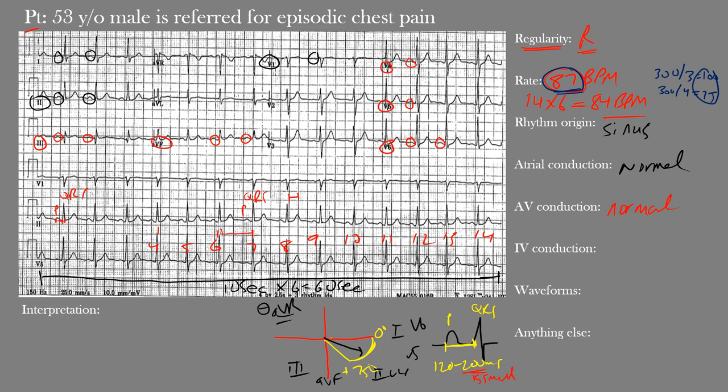For intraventricular conduction, we look at QRS duration. The normal QRS duration in adults is between 80 and 110 milliseconds, or about two to three small boxes. Here the QRS complexes are narrow and within normal limits — the QRS duration is 102 milliseconds, which falls within our 80 to 110 range. IV conduction is normal. A prolonged QRS would suggest conduction delay or aberrant conduction.